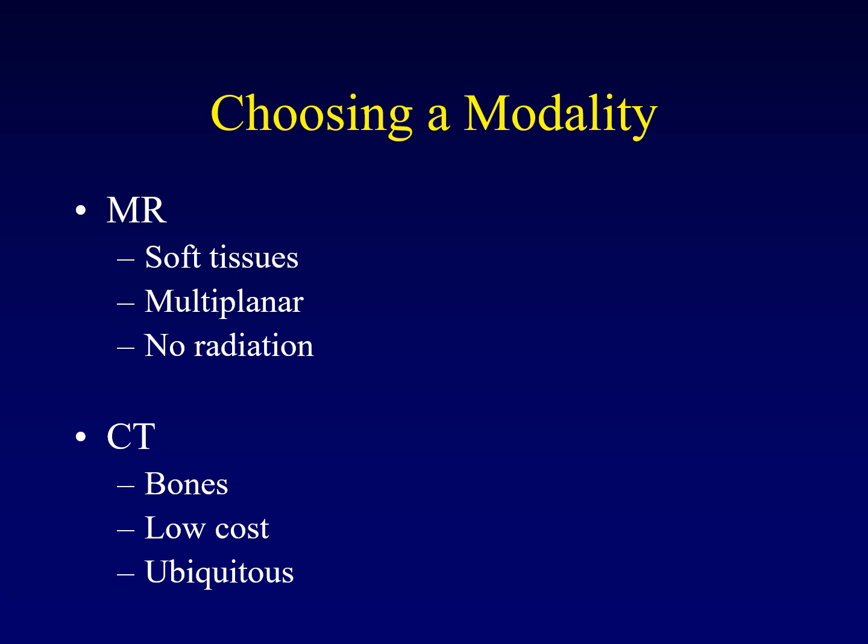Certainly patients who have metal in their bodies are at risk because of the strong magnetic field, and there's a couple of other ways that patients can become injured by MRI. MRI heats up the tissues, but it is an extremely safe technique overall. Unlike CT, where the radiation, ionizing radiation, can cause cancer.